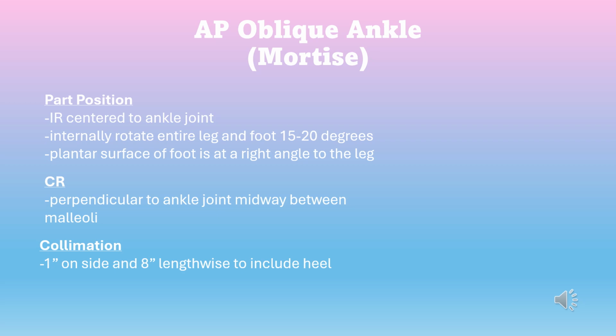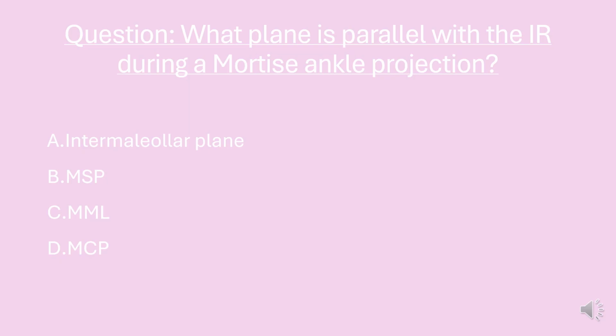is the same. I've included this question into my PowerPoint, and it is, what plane is parallel with the IR during a Mortise ankle projection? A, intermalleolar plane, B, mid-sagittal plane, C, mental meatal line, and D, mid-coronal plane. The answer is A, intermalleolar plane.